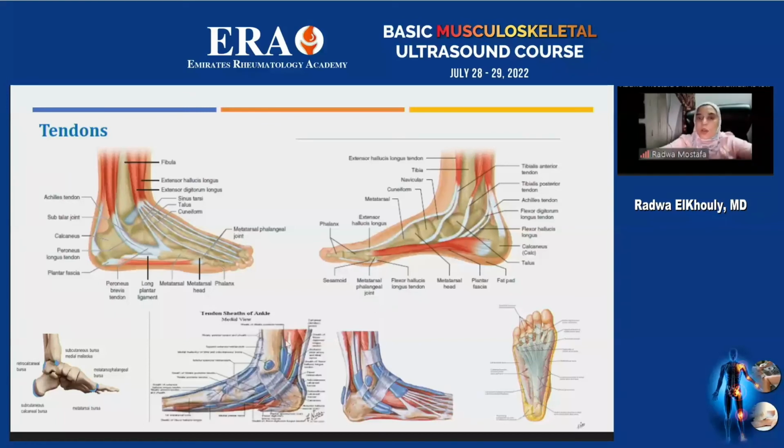All the tendons in the ankle and the foot have a synovial sheath that ends just before its insertion, and in the plantar aspect we have a connective tissue structure, the plantar fascia, which is attached from the medial calcaneal tubercle to the metatarsal bones. Okay.